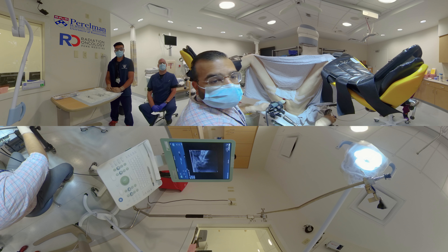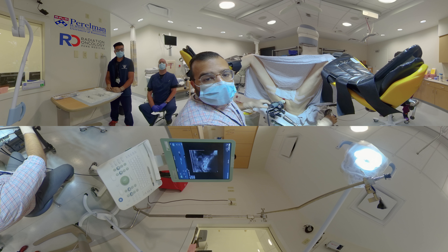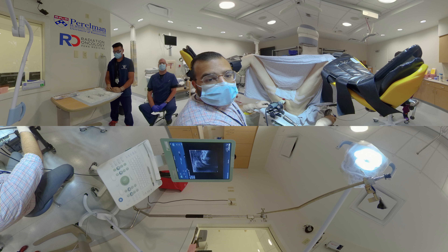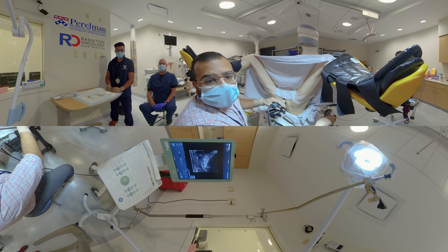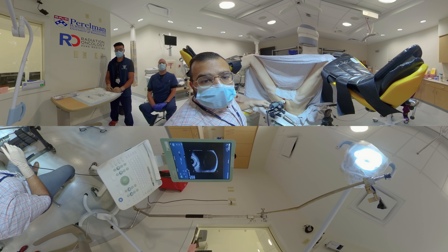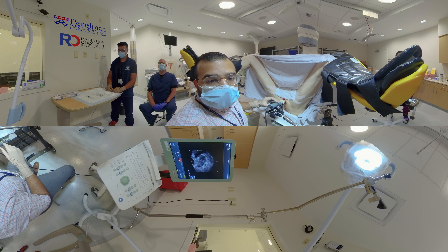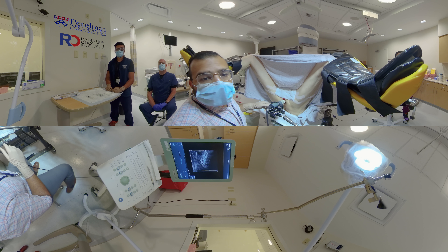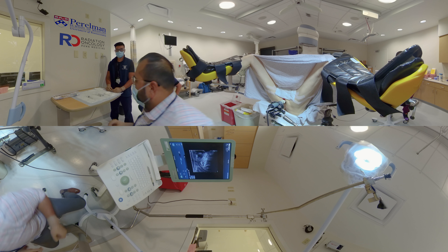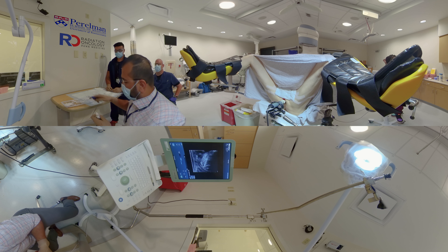I'm adjusting the ultrasound to let some gas escape from the patient's rectum, then replacing it in the ideal position. We're identifying the perfect landing zone. We set the ultrasound to be in the midline urethra on the sagittal view and identify the rectal wall as well as the perirectal fat — the perirectal fat will be bright on the ultrasound. We'll switch to the axial view and confirm this on the axial positioning. Now that the prostate is in the ideal position, we've identified our landing zone and will start assembling the SpaceOAR hydrogel kit.